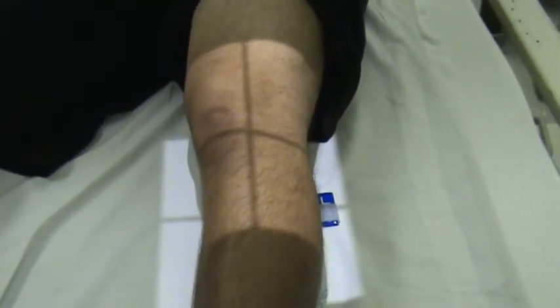Our center ray will enter at 1/2 inch below the patellar apex. Make sure you collimate down to only the field that you need and that your marker is free of the anatomy.